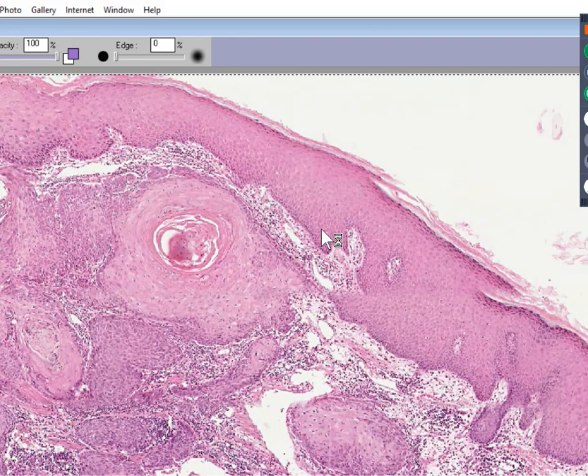And another thing they have in common is that they're both highly caused by sun exposure, even though there are other causes of them. And the third common primary skin cancer, which I haven't talked about yet, but it does metastasize and it is often fatal, is the malignant melanoma. And that's what we're going to see next, because the malignant melanoma is called Derm SC13 in our slide box.